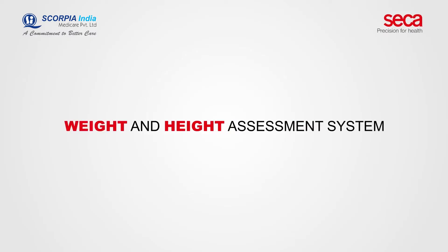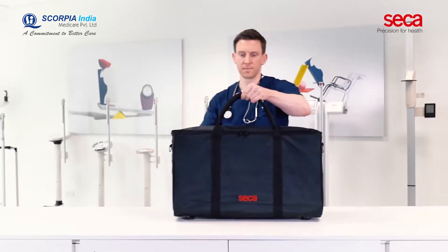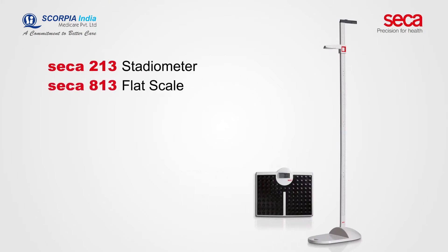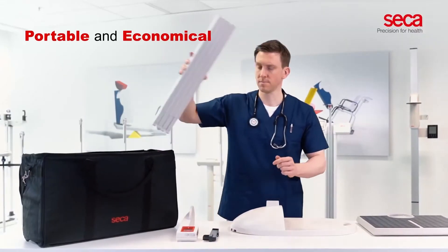An economical weight and height assessment system for use in the field. The combination of the CECA 213 Stadiometer and the CECA 813 Flat Scale is a weighing and measuring solution that is portable and economical.